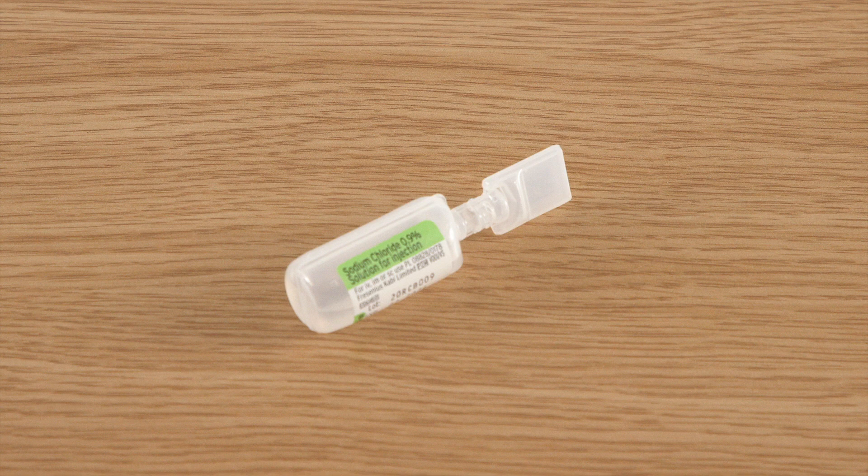If I am using more than one ampoule, or if the device I am flushing has more than one needle-free access device, then I would need to collect additional wipes as appropriate. Finally, I have an ampoule of sterile 0.9% sodium chloride. The solution and expiry date need to be checked. Current guidance for flushing vascular access devices is that we use at least double the capacity of the device lumen, so you might need to use a larger volume of flush solution depending on the device you are using. Paediatric and neonatal services may need to consider a smaller flush volume.